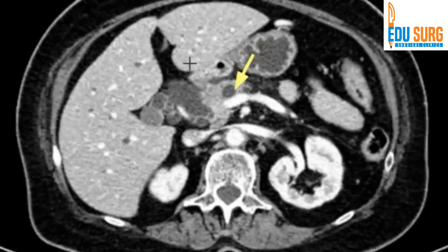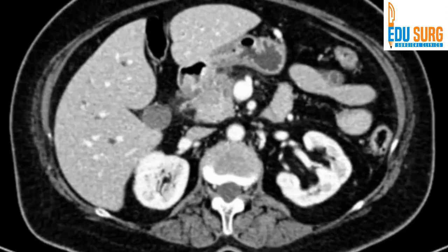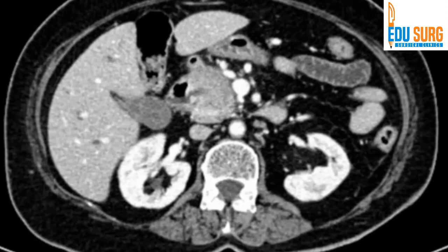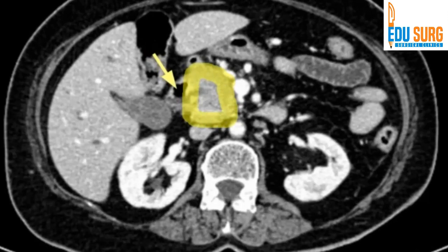What the arrow is pointing towards is the dilated pancreatic duct and the dilated common bile duct. This is known as the double duct sign, which is pathognomonic of a pancreatic head cancer. You can appreciate the double duct sign, and that part where the ducts have disappeared is the tumor — the mass being highlighted in the head of the pancreas as well as extending into the uncinate process. The arrow is pointing towards the duodenum. So this case is a case of pancreatic head cancer.